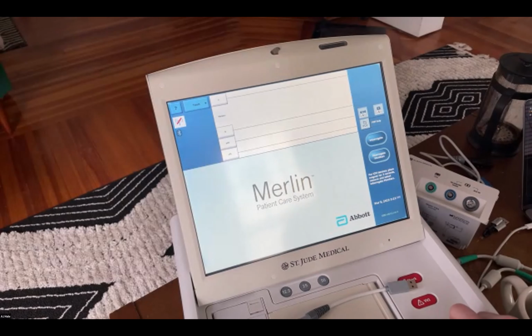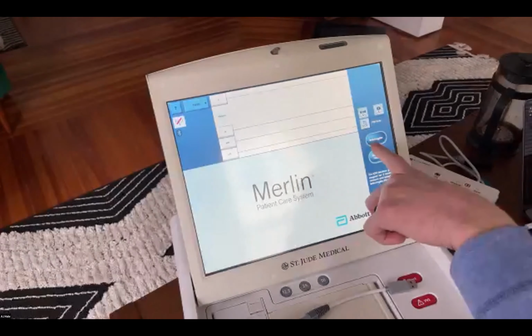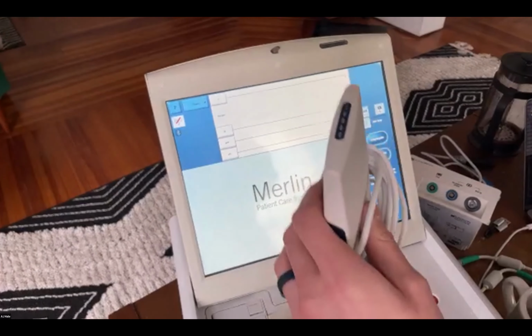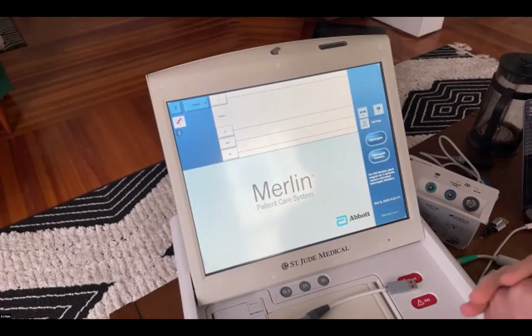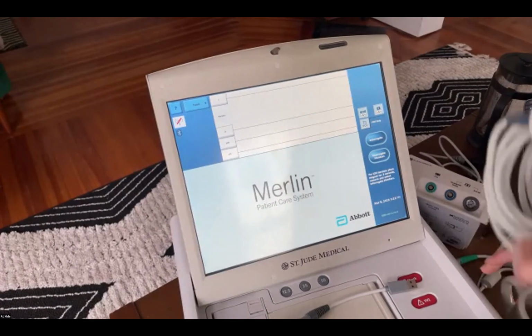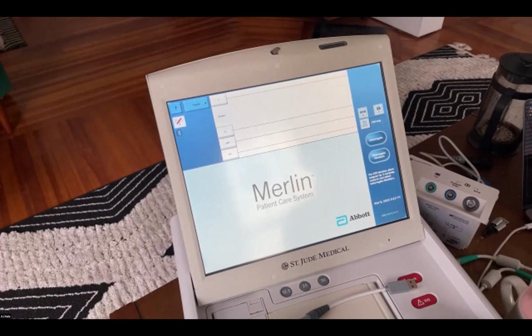When you actually have a device and a wand is connected, you have the ability to interrogate. You press interrogate right there. It will speak through induction to make the initial connection. Once a connection is made, if you have a remote telemetry wand and the device is capable of communicating through remote telemetry, it will disable the induction wand and move to the remote. But that is through the interrogation button.